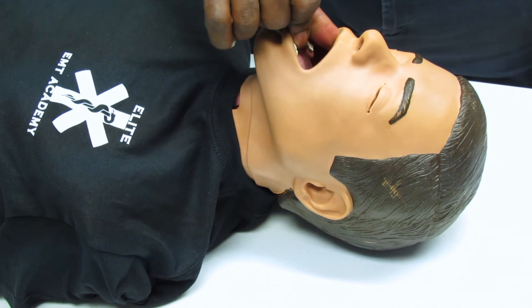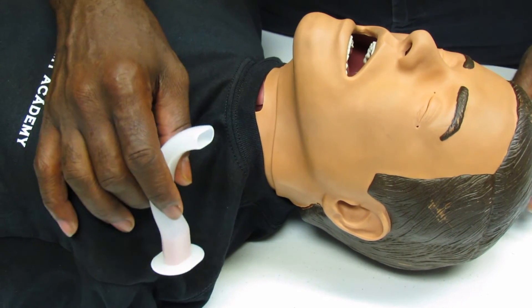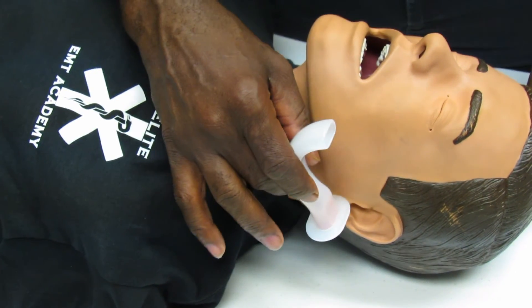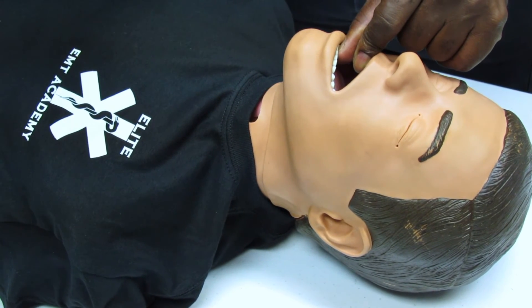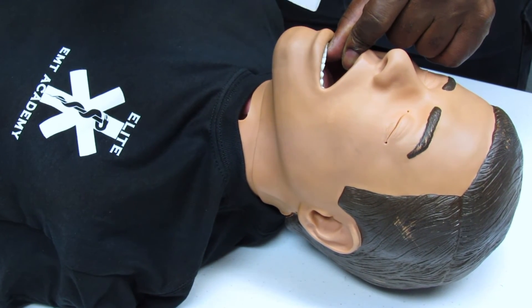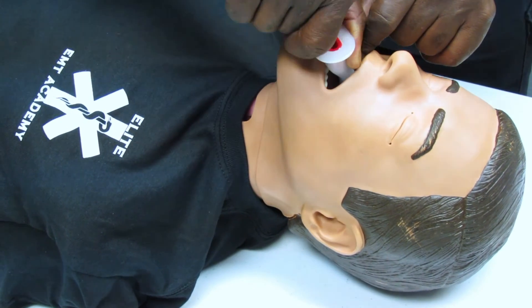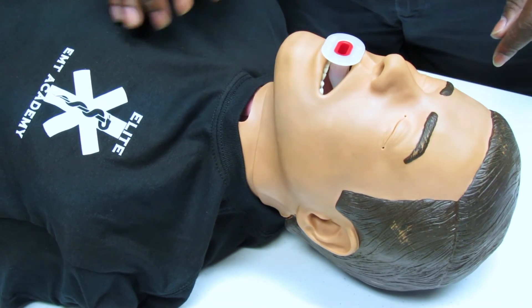Open the airway and prepare to insert the proper size oropharyngeal airway. Before inserting, measure from the tip of the earlobe to the corner of the mouth to select the correct size. For insertion, go in halfway, then turn 180 degrees to suppress the tongue to the back of the mouth. Confirm it is properly placed.